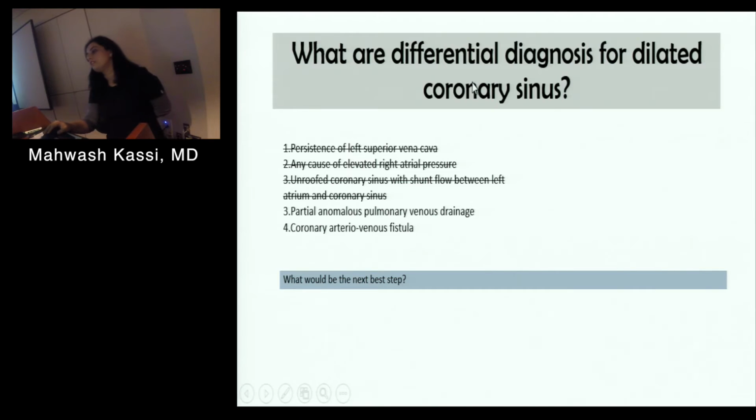But the point is, you can't go back. So if you're really suspicious of it, a TE is not going to be satisfying. No, that's absolutely right. But I'm just trying to make a teaching point here. I think the issue is if you don't have access to cardiac MRI, most places have CT. Right, and a CT scan can also help you.